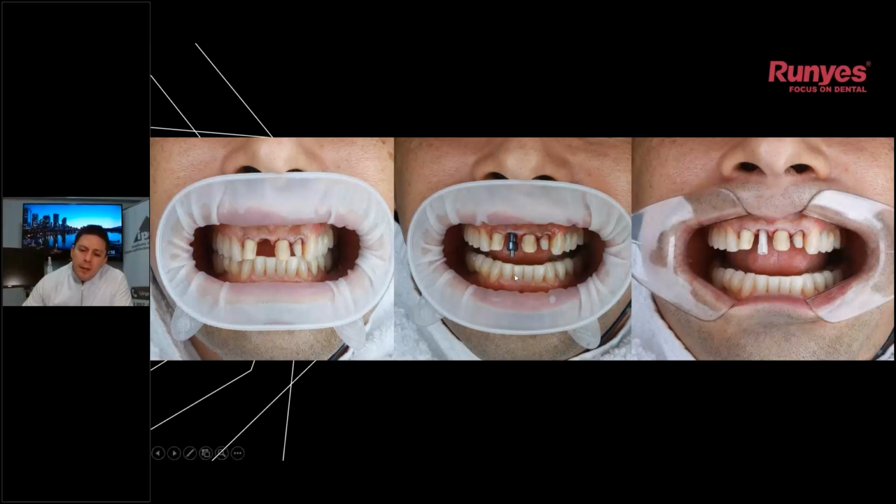The middle image is the normal way that we do the scan, the scan that we always do, the normal way with a silicone, with an open tray mold. And on the right, in the last image, we can see the scan body that helps us to digitalize this case.